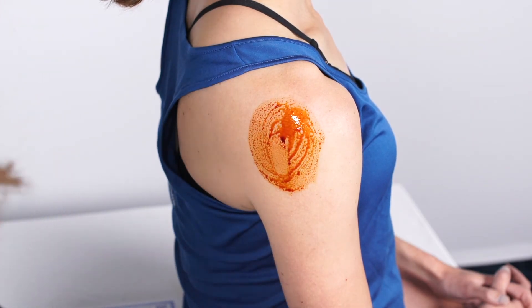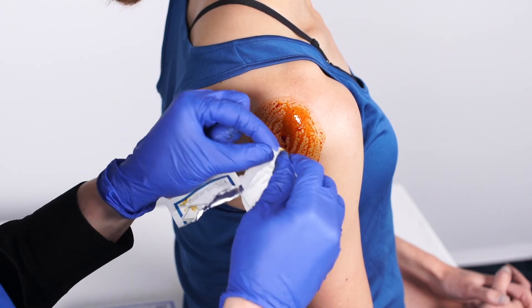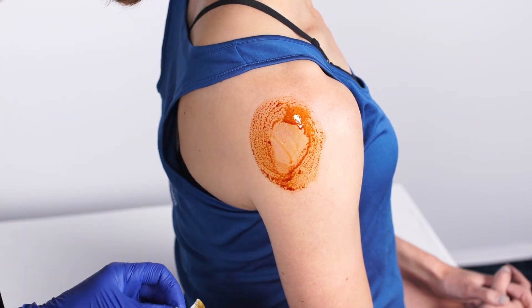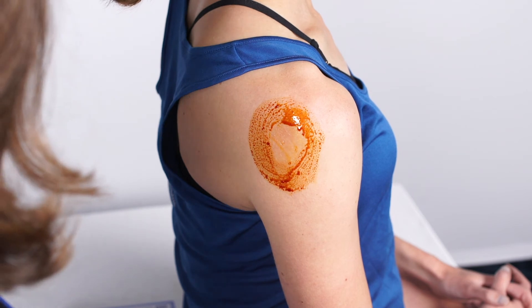Once the betadine has had a moment to dry, I'll take an alcohol swab, hold the corner of it, and bring it across the site I've prepped — that really shows the landmarks well and where you're going to go.